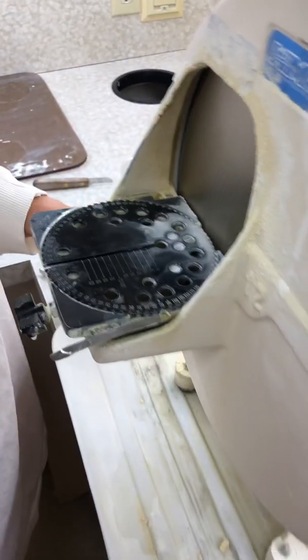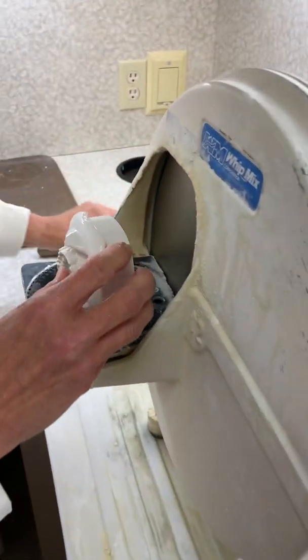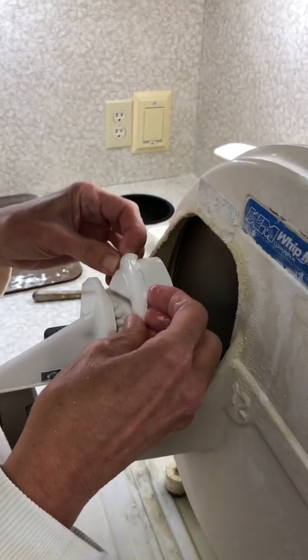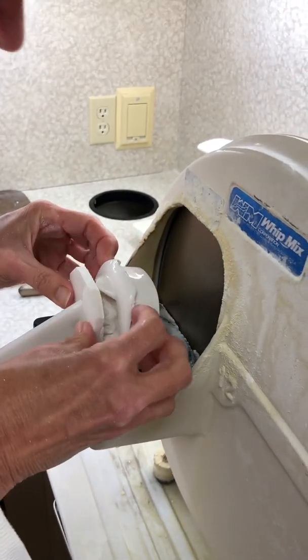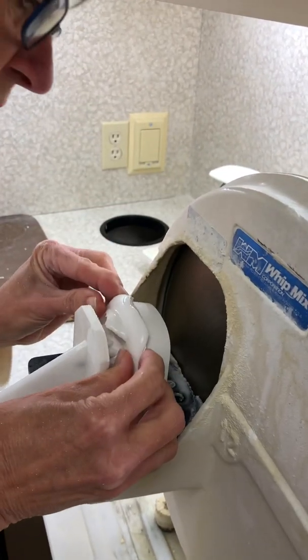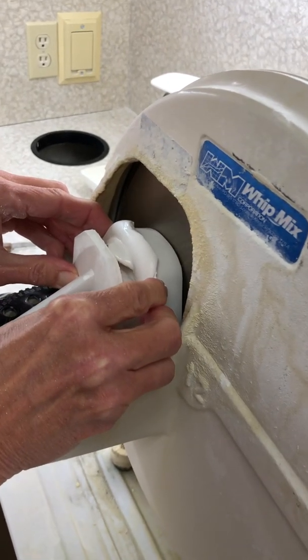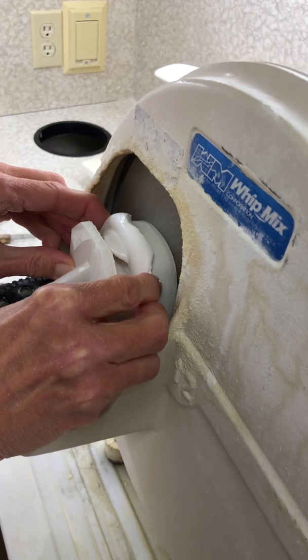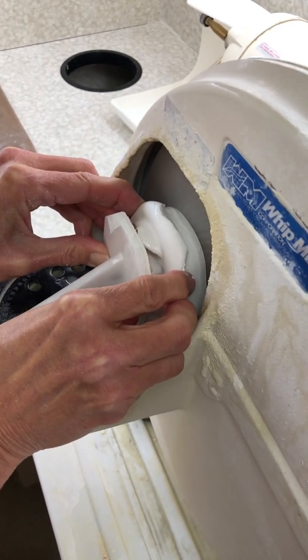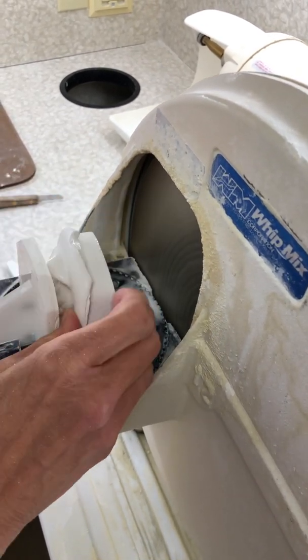Good. All right. Now the next step we want to do is we want to level off the top. All right. So we're going to take this, we're going to put it in here. With this extra part I was telling you about, you can actually grab hold of that and put the whole occlusal bite plane onto the little pad, and you just hold tight and just slowly push in. Definitely want to watch your fingers with this one.